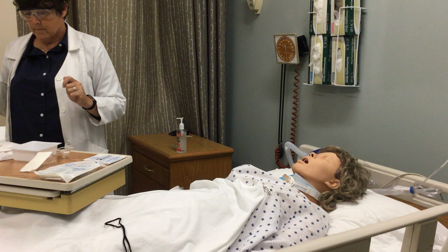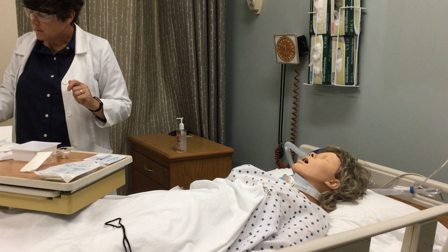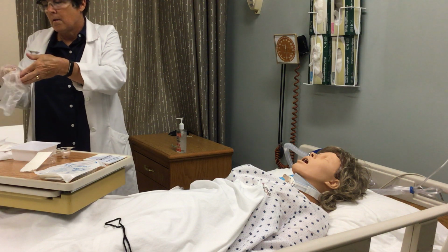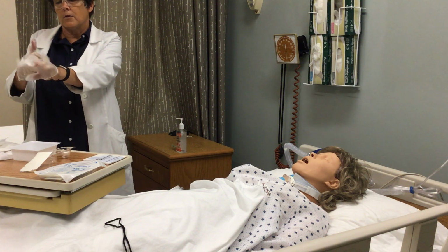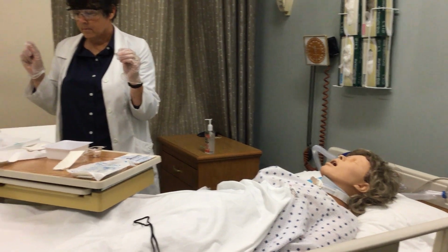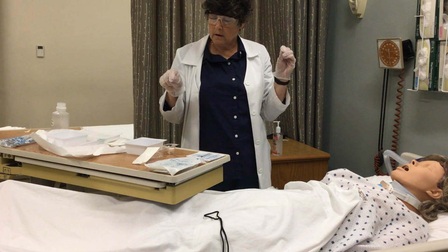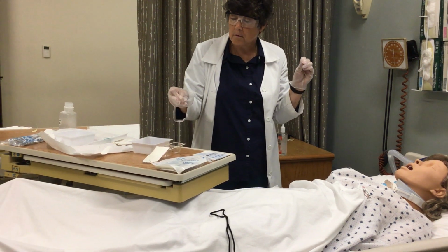Continue applying sterile gloves. Okay, so my second sterile glove is here on the field. I'm going to grab that. Of course, it's all twisted around. Alright, so I have my sterile gloves applied. Remove the new cannula from the packaging. Okay, so I have the new cannula. I'm going to grab that with my dominant hand.